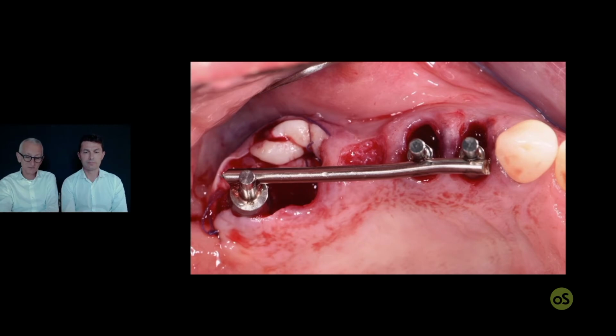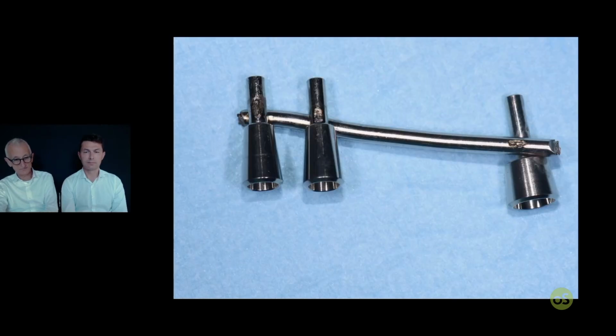So we recommend this approach, but you are most welcome to combine this shell with any kind of structure you want to use. So this is what you get from me.